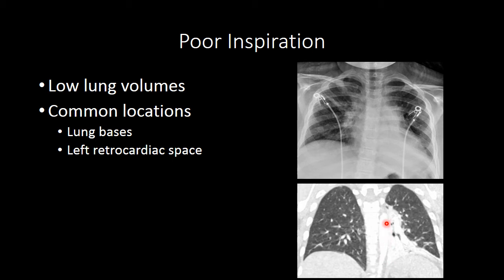Seeing atelectasis in the retrocardiac space and in the right lung base are very common locations. You can also notice that in this person, their overall lung volume is low — they don't have as many rib spaces apparent in the chest radiograph as you would see in a normal person who has fully inspired.